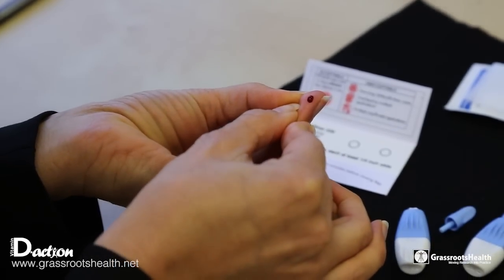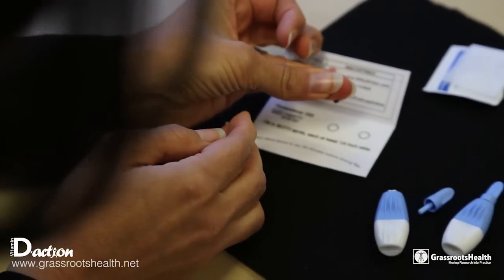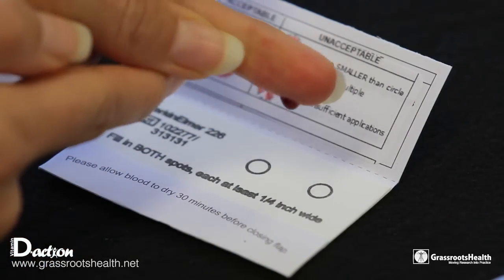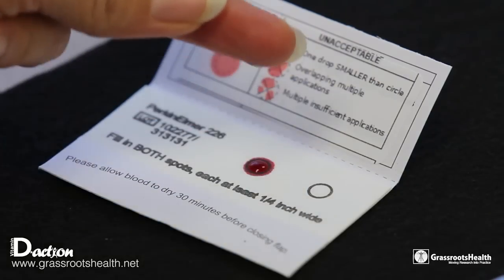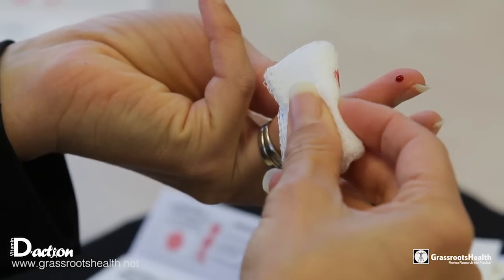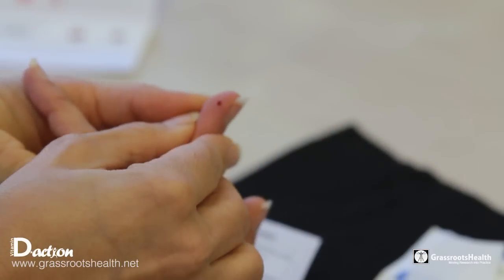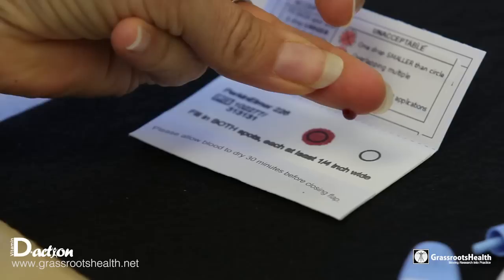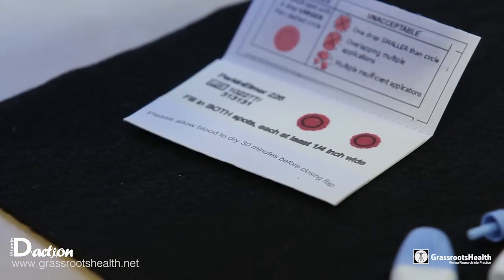Now that you have wiped your finger with the gauze, you can see that the blood is coming to the surface. All you need to do is gently milk it and hold it over the blood spot card and let it fall directly on the card. Then you can wipe with the gauze again just to keep the blood flowing, and you will see the blood coming to the surface again — that's going to be a nice good sized drop that will go straight down to the paper.